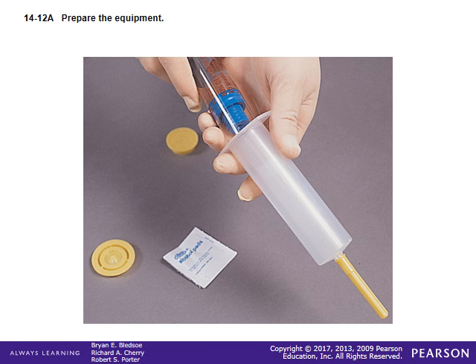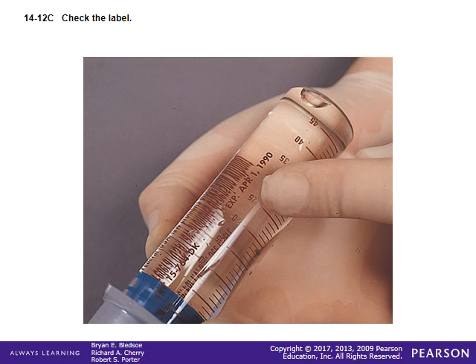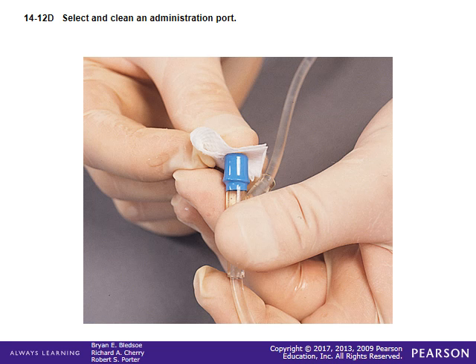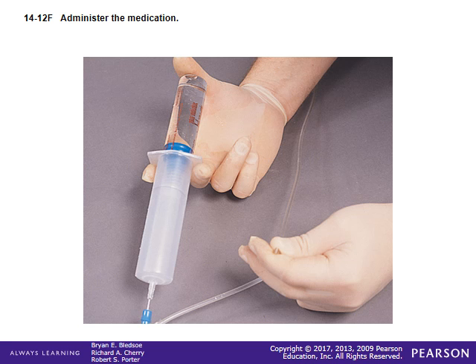Preparing the equipment often involves joining the medication with the syringe that comes in a preloaded syringe, screwing them together, making sure that the dates and the clarity of the medication is normal, cleaning off the ports where you're going to put it, pinching off the tube while you're in it, and making sure that it is done at the appropriate timing.